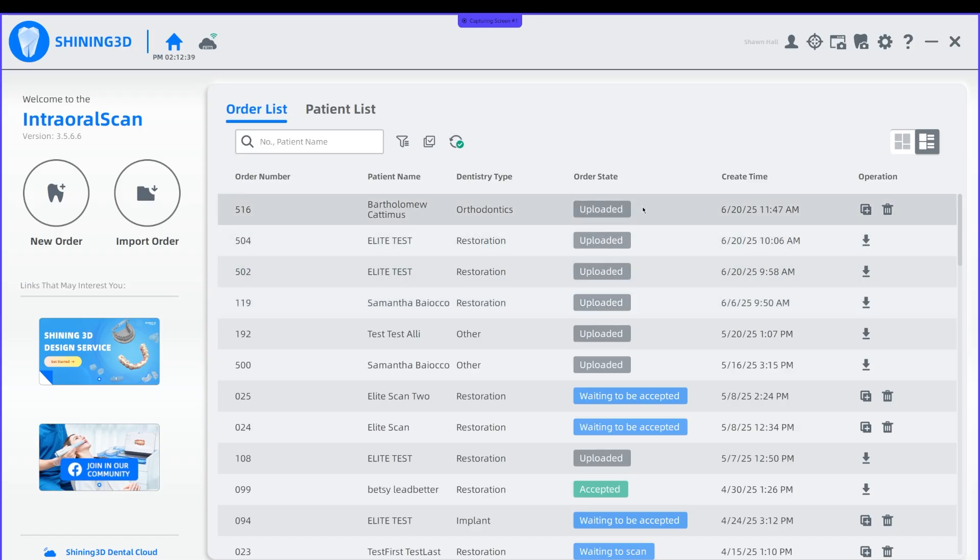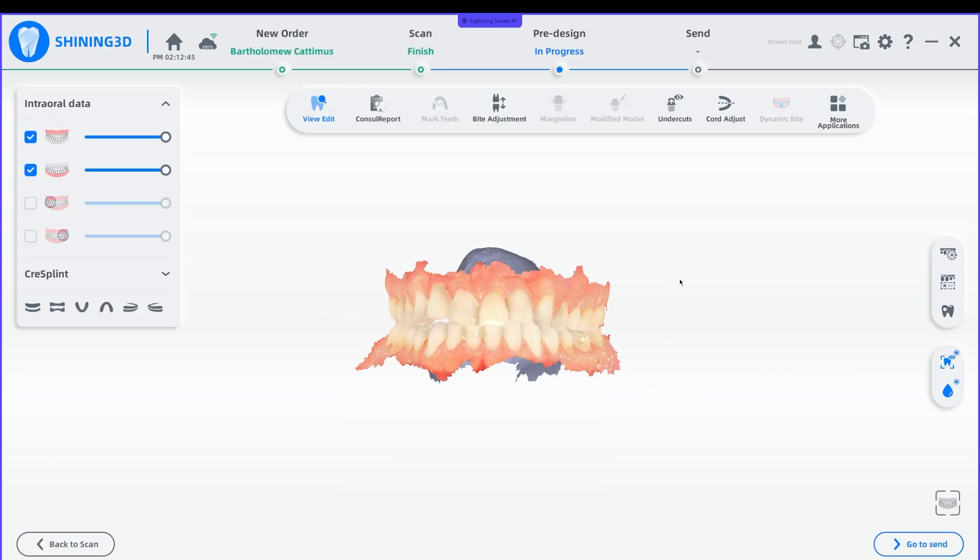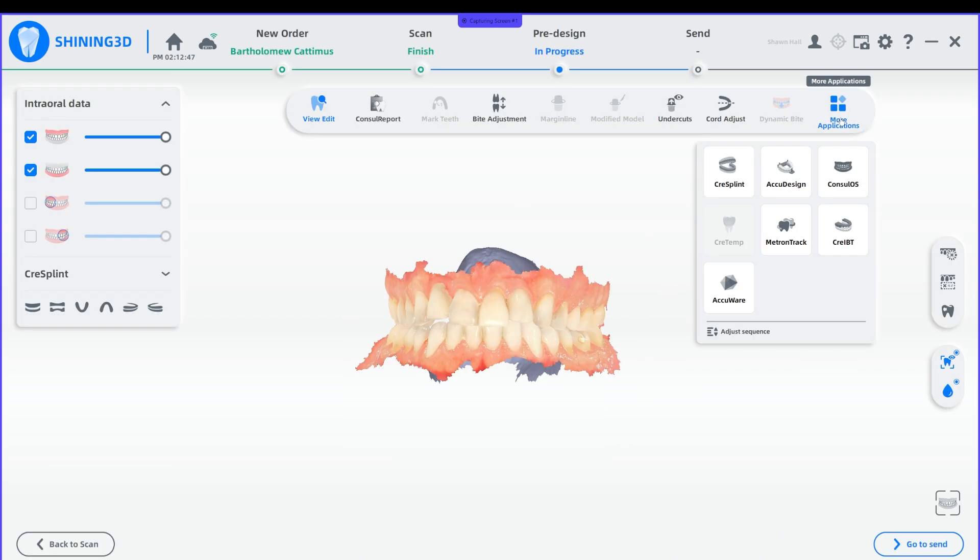Simply open up your case, go to Predesign, click on More Applications, and choose AccuDesign.